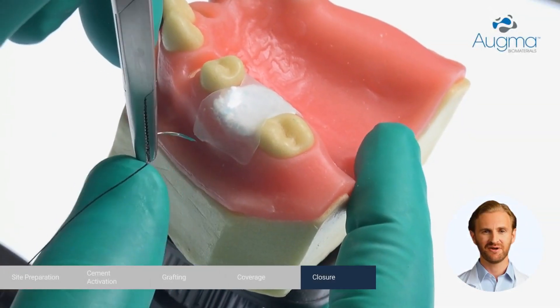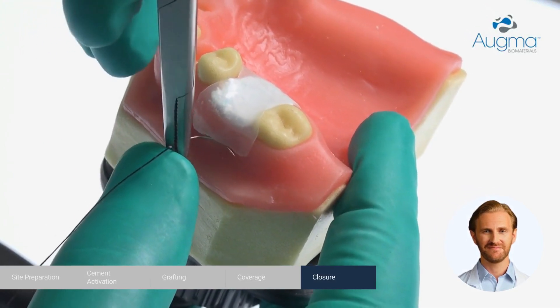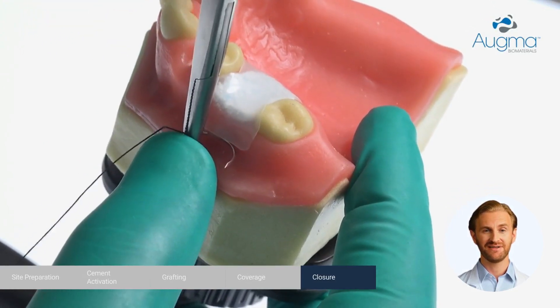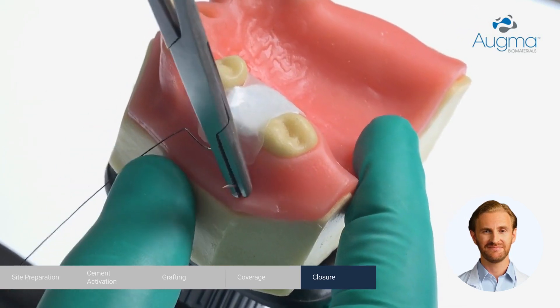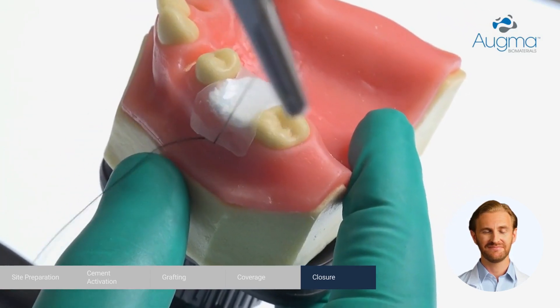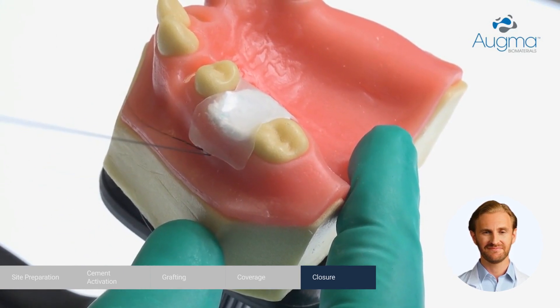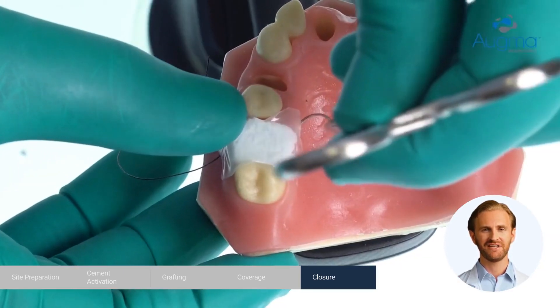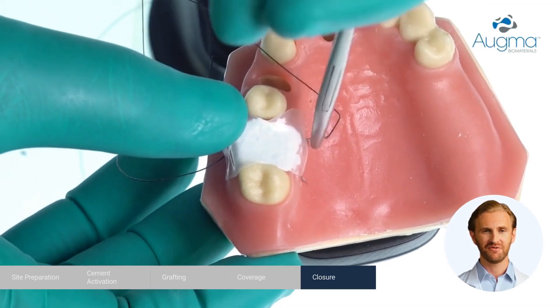AugmaShield must be secured with simple cross mattress sutures for a period of 12-14 days. Start from the buccal aspect by suturing from the mesial part to the distal. Continue to the palatal aspect from the mesial through the distal in order to create a cross suturing above the AugmaShield.